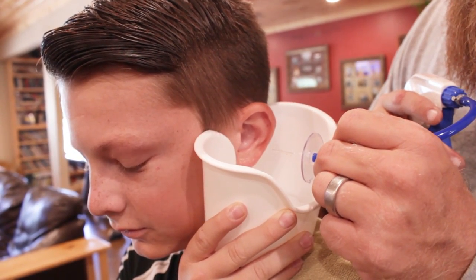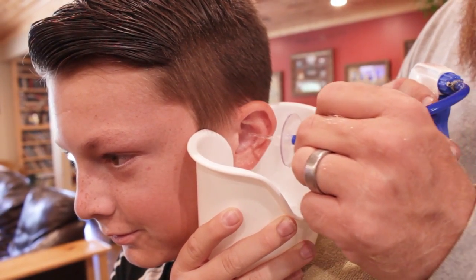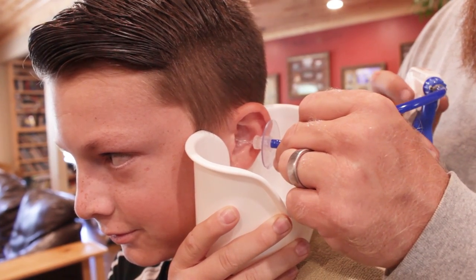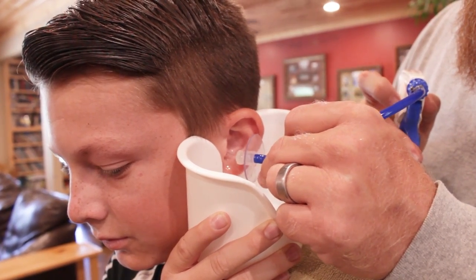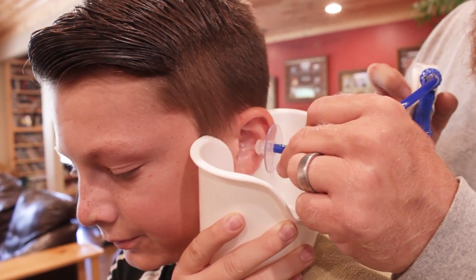You doing okay? [Son: Mm-hmm.] Doesn't hurt or anything? [Son: Nope.]